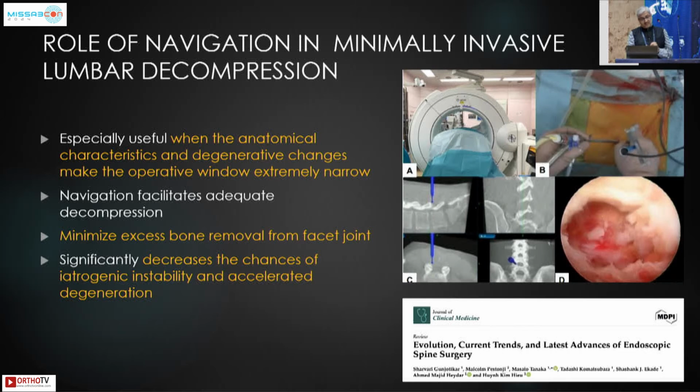It's also very commonly being used by the endoscopic or minimally invasive surgeons, where the navigated burrs can help you do adequate decompression, as well as prevent iatrogenic instability and excessive removal of the facet joint.